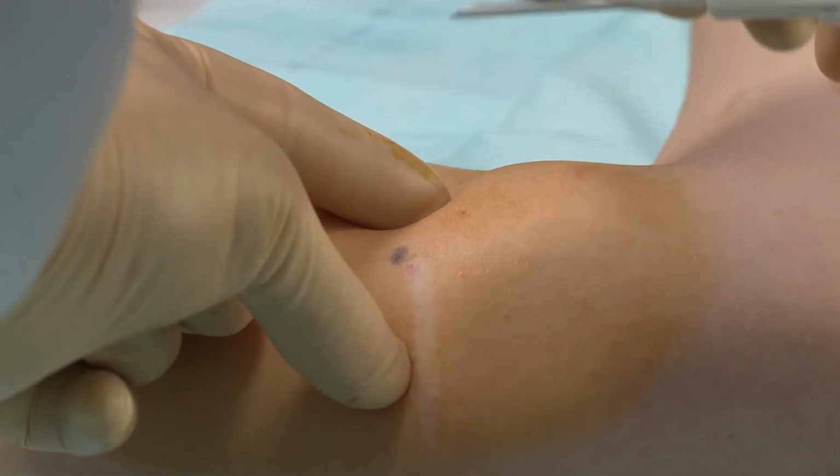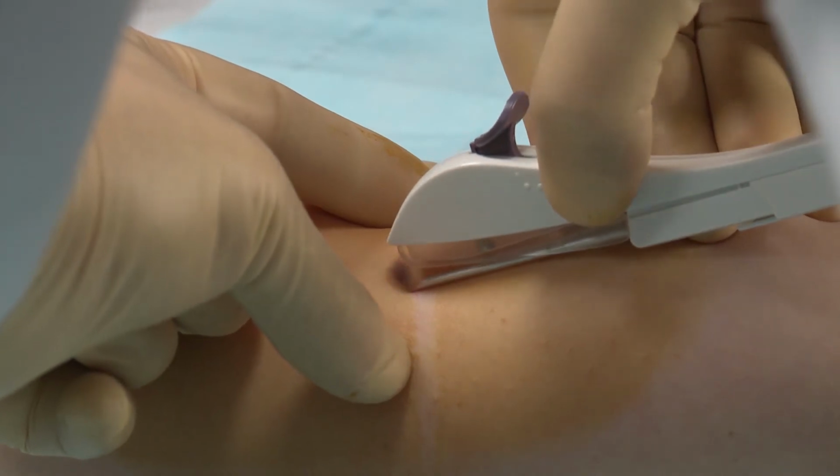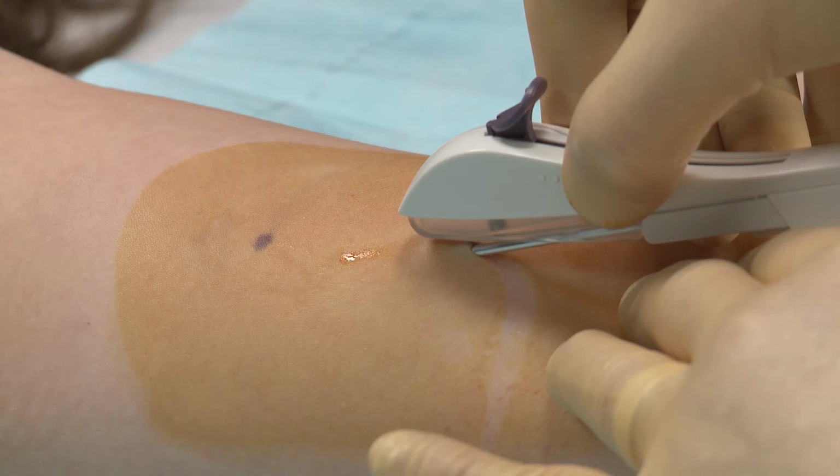With your free hand, stretch the skin around the insertion site with your thumb and index finger. Puncture the skin with the tip of the needle slightly angled less than 30 degrees. It's important that you're in a position during the entire insertion procedure to clearly see the movement of the needle just under the skin. Generally, you can see movement of the needle best if you're seated and looking at the applicator from the side and not from above.